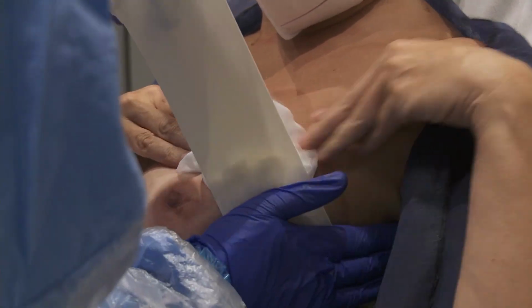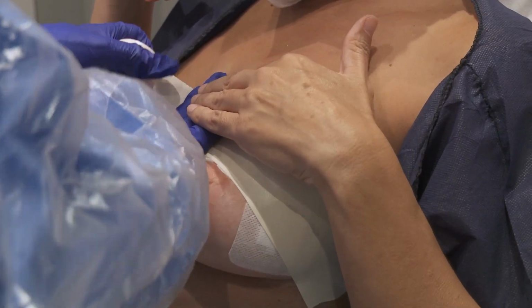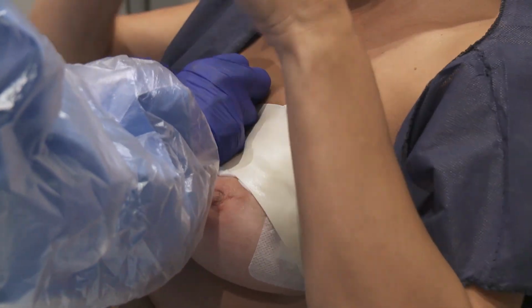Additional gauzes are placed on the biopsy area for tighter compression and a compression bandage added, which must remain in place 24 hours.